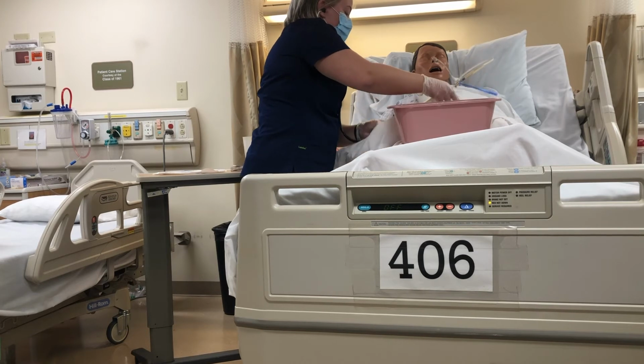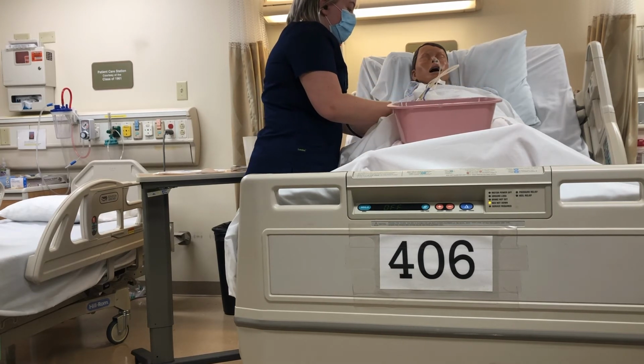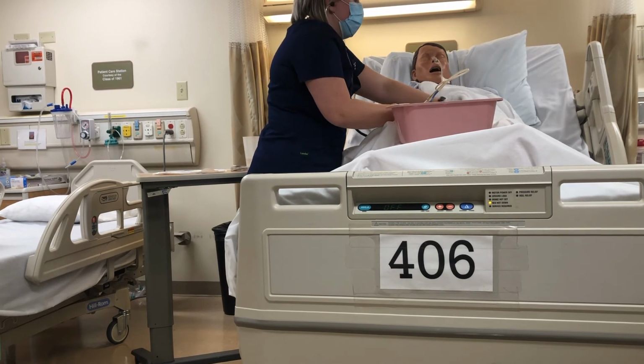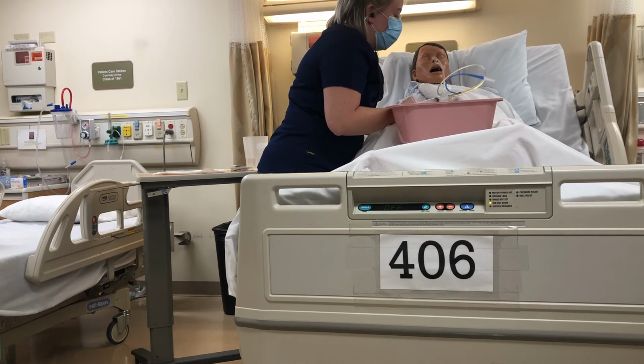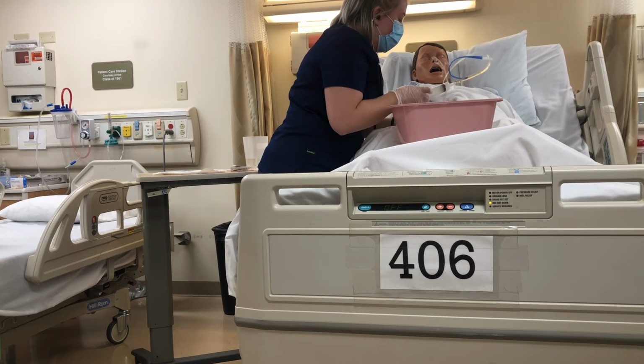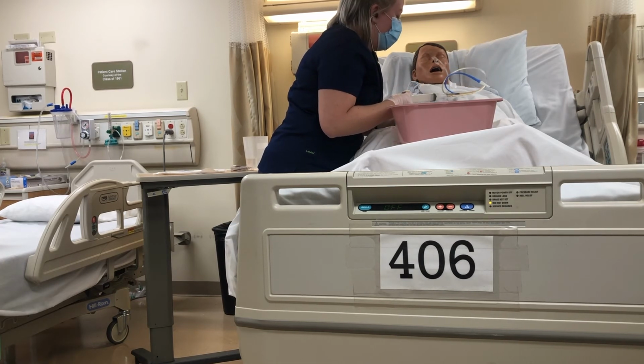Towel. I'm going to raise your gown a little bit. Like I said, we'll be using the left upper quadrant. Okay. Ready? 1, 2, 3. Perfect.